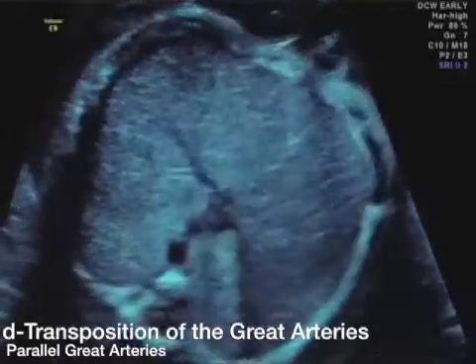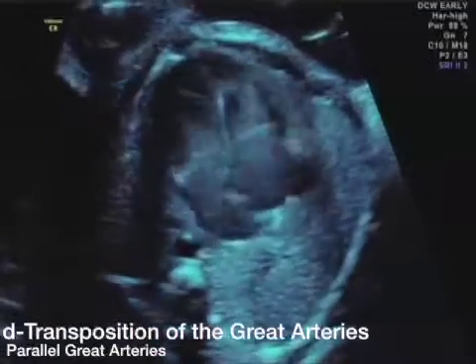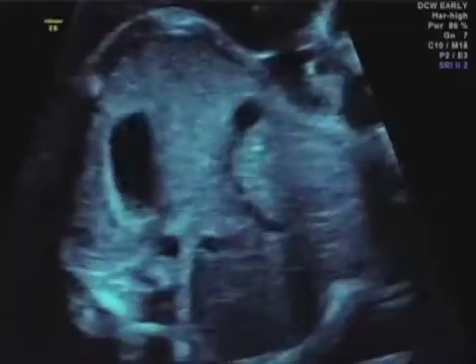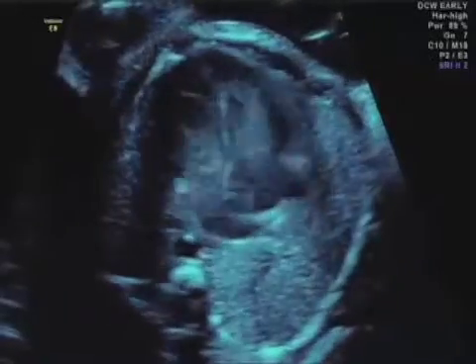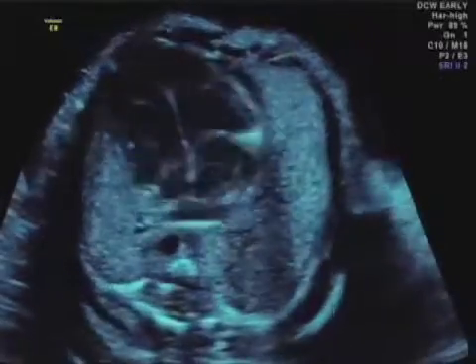Here we have a relatively nice sweep through the four-chamber view — excellent, a beautiful four-chamber view. We really do not see anything wrong, other than maybe too much harmonics in the system. The heart may be a little bit large.